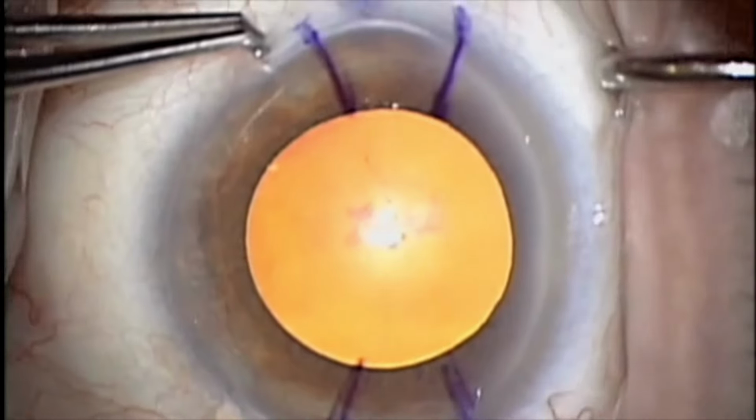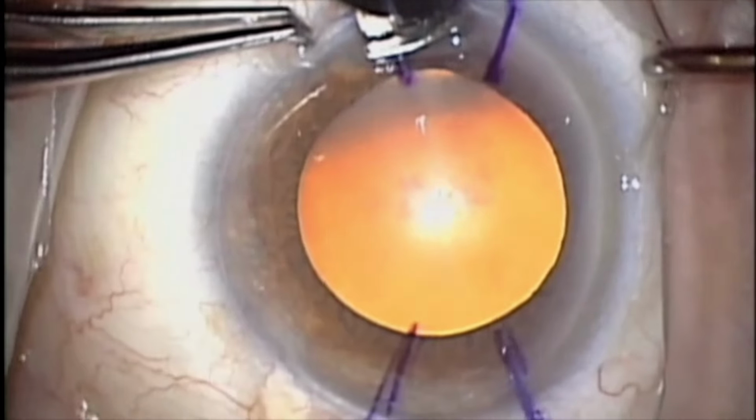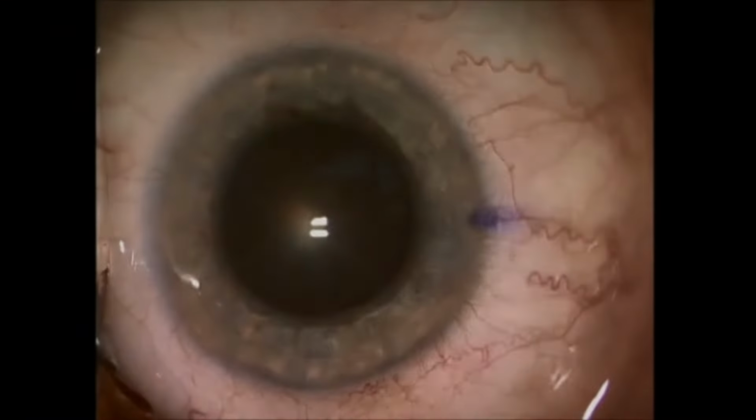There are various ways to achieve this and various blades that are available on the market. It's important to familiarize yourself with the different options that are available. But again, I'm depressing onto the cornea, letting the blade relax, and then traversing from one mark to the other. You can then proceed with your normal phacoemulsification technique. I'm going to demonstrate an LRI now.